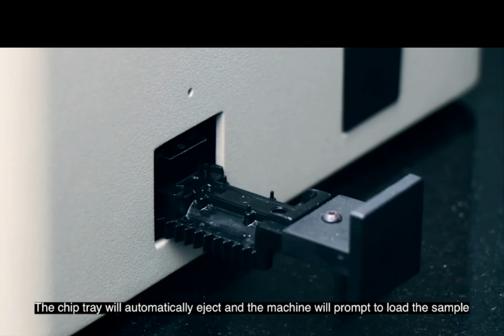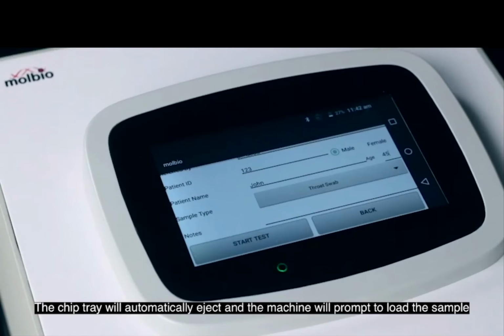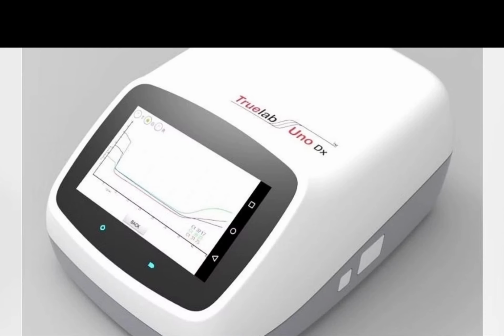Start test. Once you press start test, if you have a duo module, this will automatically open. This is the place where you are going to keep the chip. But if you have a Uno module, it won't open. So next to the chip tray, there will be one button which you have to press. Okay. So here the Uno module.